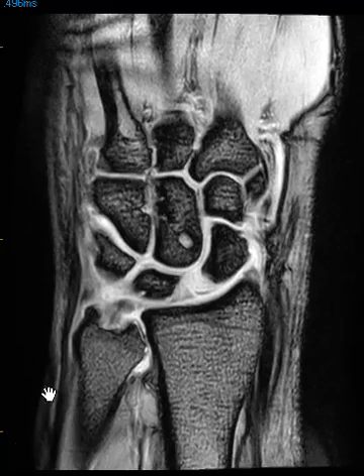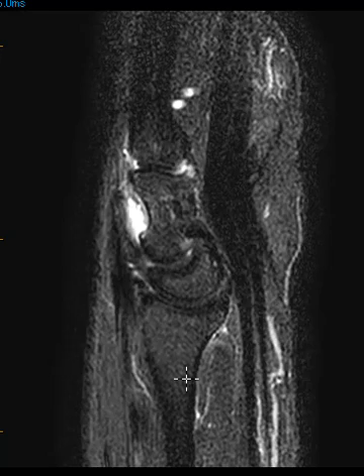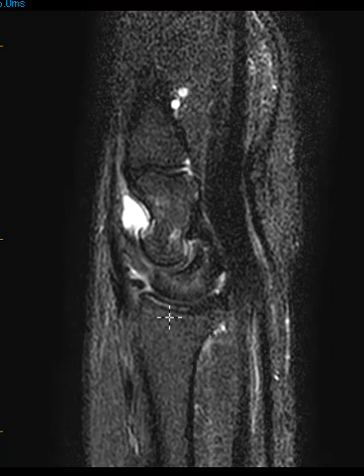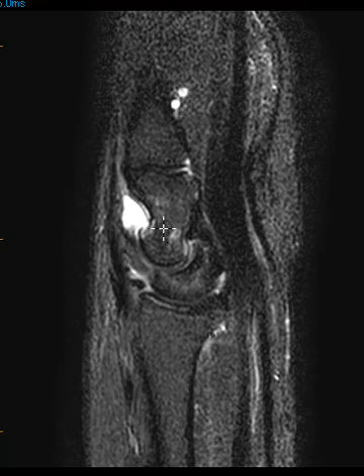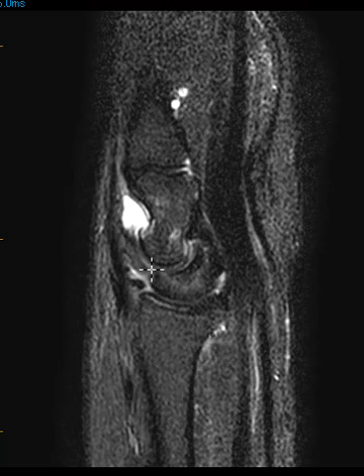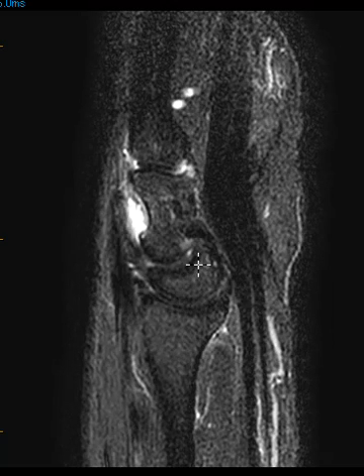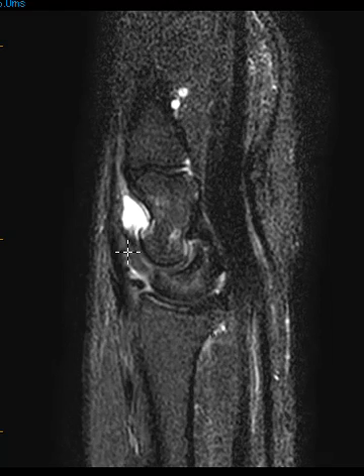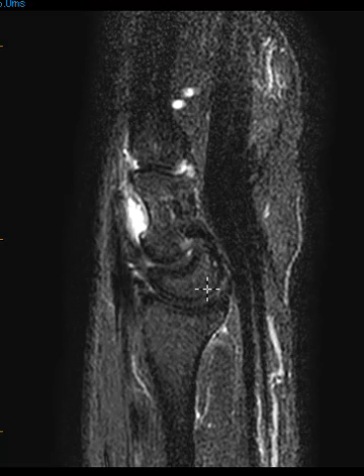Now we're going to go to a sagittal view. In this view, we see the radius and we see the capitate bone here. They're about normal in orientation relative to one another. The capitate bone may be slightly posteriorly subluxed, but the lunate bone is abnormal. Instead of a nice cup facing straight forward, it looks like it's tilted dorsally — this is dorsal tilt of the lunate bone.